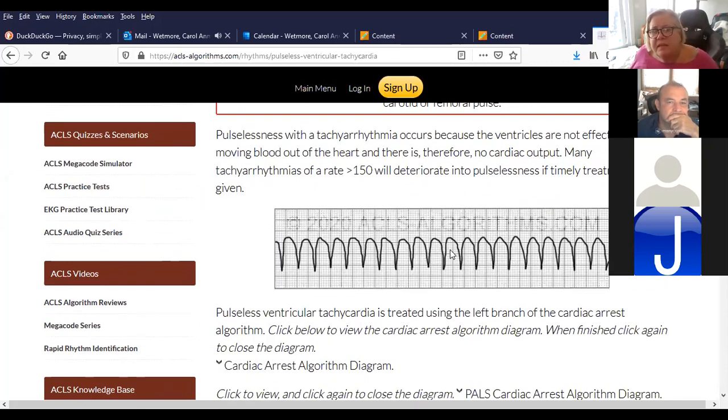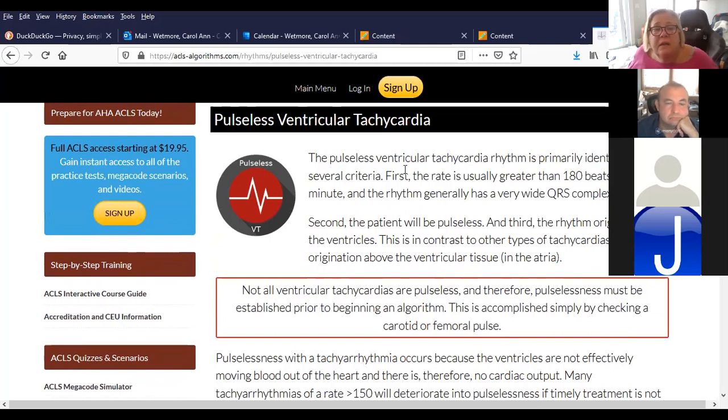I think these are very nice tracings. We know in real life that not all tracings are nice and neat and easily readable. You will definitely have people asking, is that really the P wave? Can we get the patient to stay still? There are certainly lots of tracings out there that are less distinct than this, but I think they've chosen some nice ones in this program that you may see again, if you know what I mean.